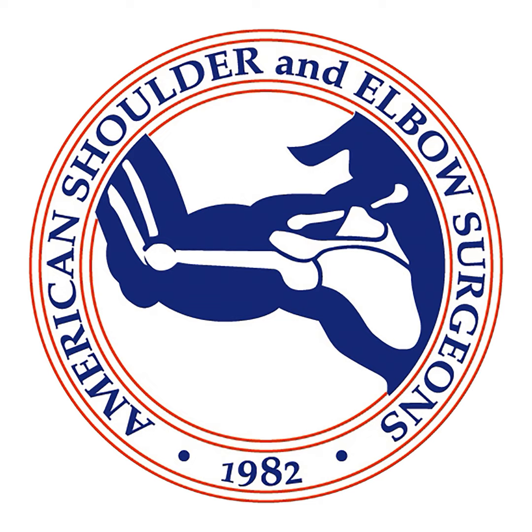And on those, I'm going to put a dermal allograft over the top because the biologic augment provides biology, but it doesn't have any structural properties. So in those type 2 failures, I want something a little bit stronger. So then I'll add a dermal allograft over the top of the repair.